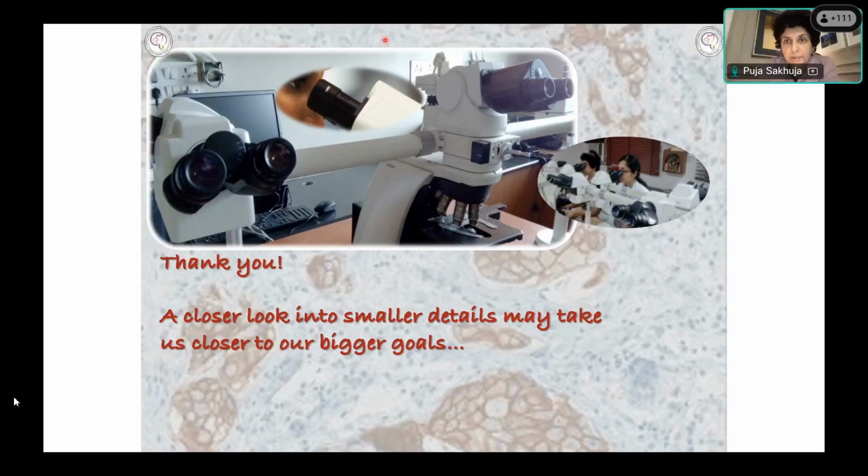Yes, yes, please. If only one colonic crypt is showing one neutrophil, then do we say it as cryptitis? No, well, even if one colonic crypt is showing one neutrophil, you may have to call it cryptitis, because after all, you're just seeing a small biopsy. You don't know what's happening elsewhere, but that does not necessarily make it an active colitis or something. So you have to say what you are seeing. You have to call it, but you have to be very sure that you are seeing a neutrophil. So that little bit of cytoplasm around it should definitely be there.